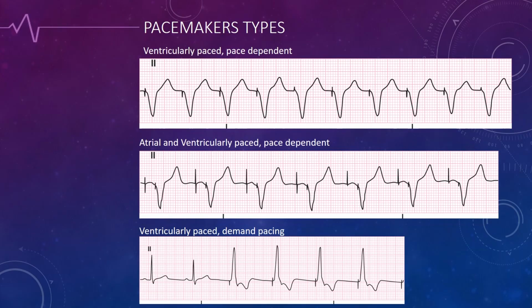Oh, actually, this is a really good example. So I said in every one that looks the same. Let's say I see this spike right here, and I note this thing's big and tall and pointy, right? Well, it's not fair to compare that to this guy. This guy's obviously not that guy, right? But I can look at this guy, this guy, this guy, and this guy, and oh yeah, I do see that spike in every single one. It must be paced, right? Okay, good. Pacemaker malfunctions, leave that to me to diagnose.